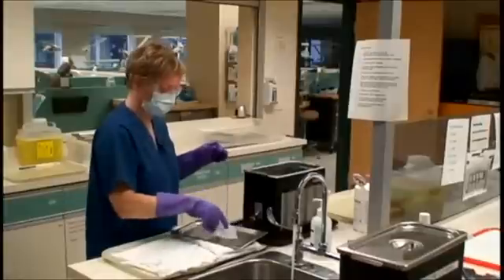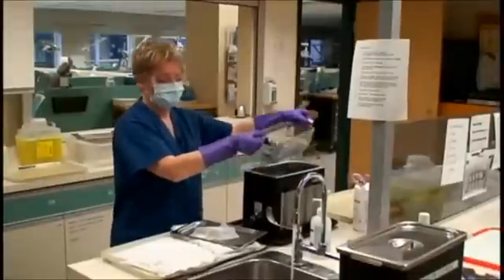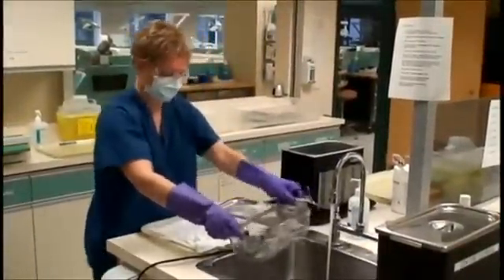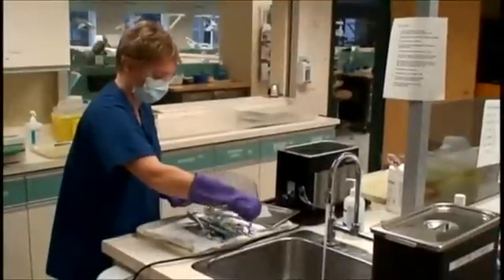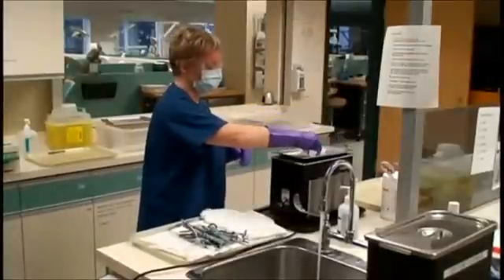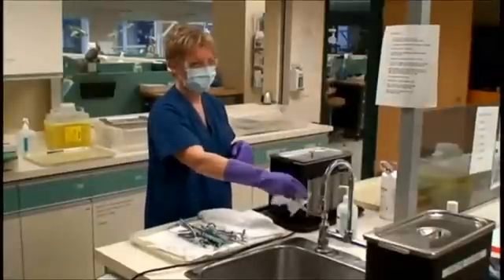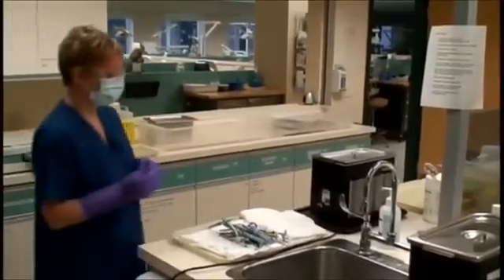With a wipe, turn on the tap. Lift the basket from the ultrasonic and drain. Rinse the basket under water, drain, and then dump the basket of instruments onto the towel. If instruments need to be processed from the stainless steel bins, place them in the ultrasonic at this time, then replace the lid holding it in a wipe, and turn off the tap holding it with a wipe.